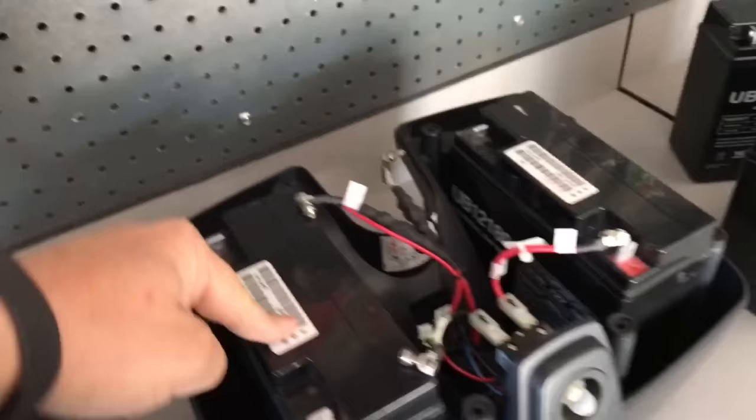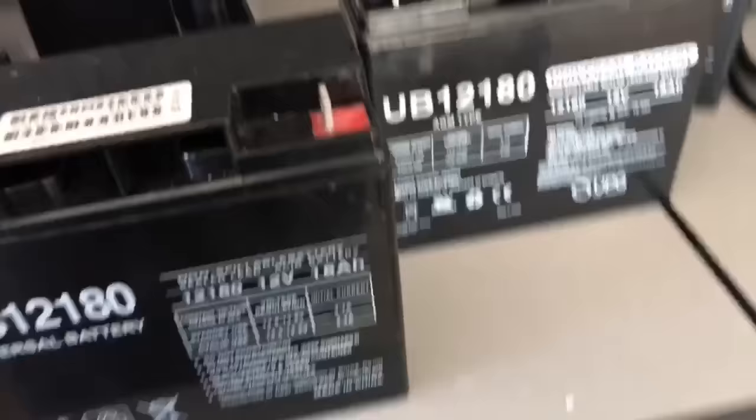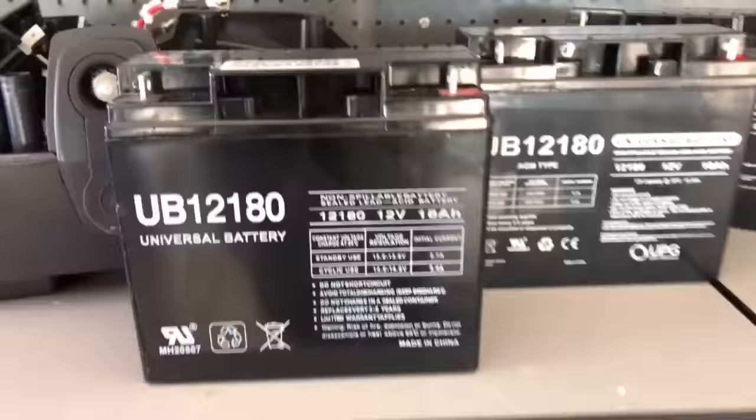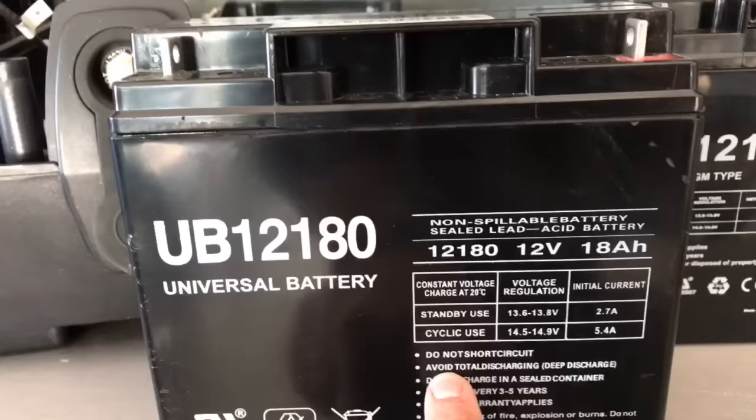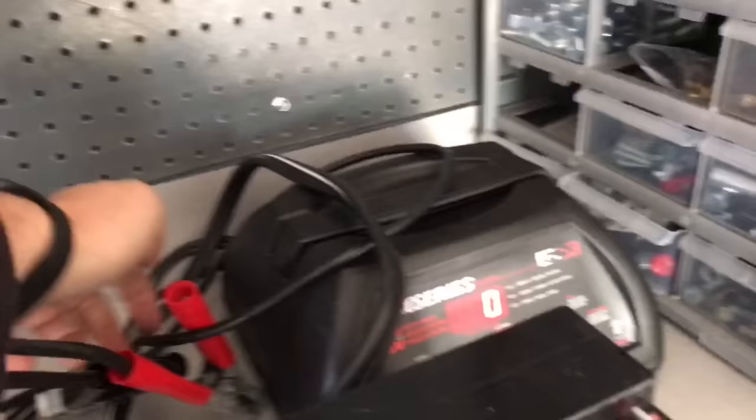Before you buy new batteries, if you have a battery charger or a multimeter, go ahead and hook up to them. These batteries even say on them: avoid total discharging, which is a deep discharge. The reason they say that is because these AGM batteries are a pain to get to recharge back up.